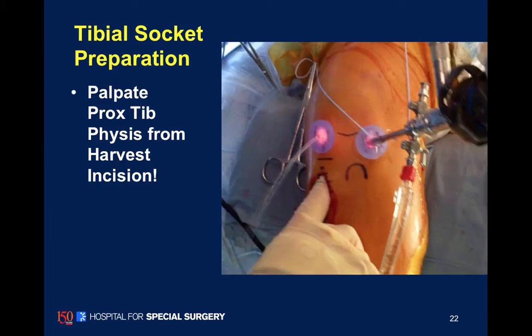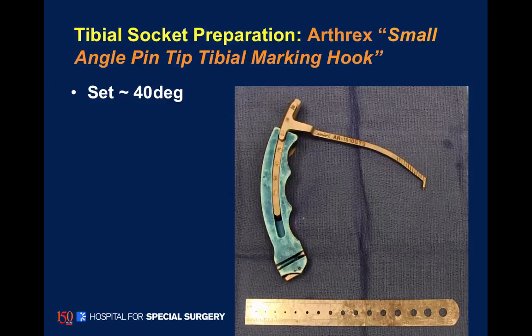One of the things we found by using this incision is you can actually feel the growth plate. You can feel the concave epiphysis of the tibia and the flatter metaphysis and the growth plate. This really helps us for placement of our tibial socket.